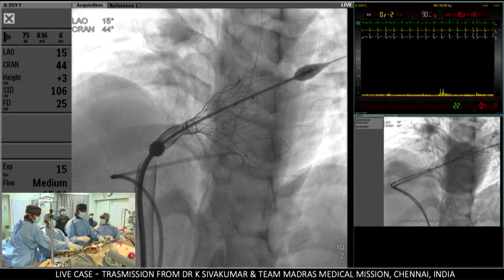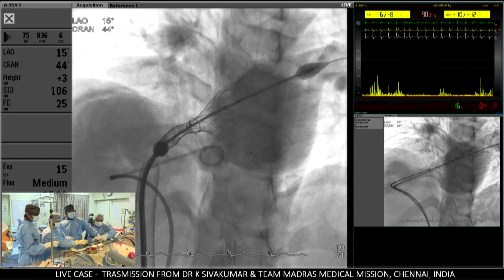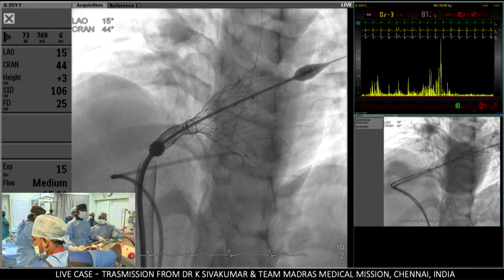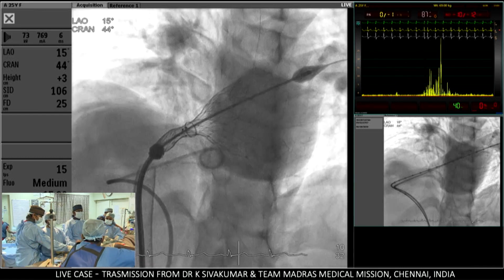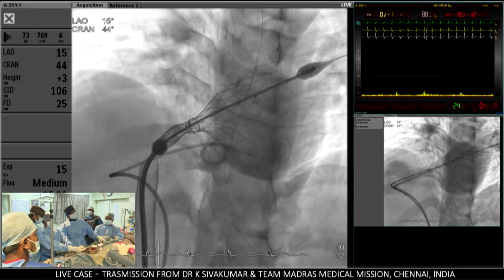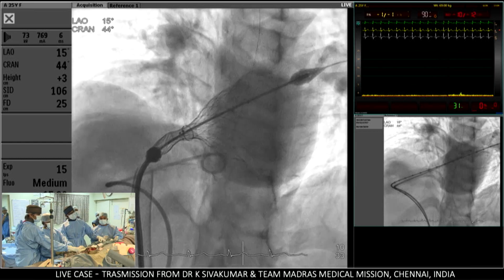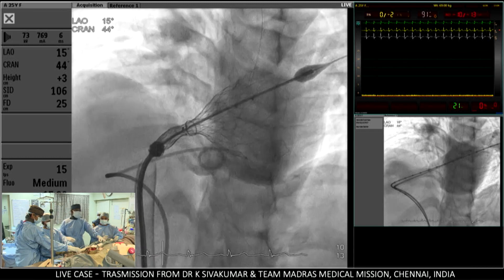I think I'm happy here, Pramod. Varakan, Tejasvi, can you get the injection? Now, see the picture. Well, Shiva, may I say something on this? Yeah. For me, the worst case scenario will be if the proximal flare is not catching the waist, and then it will fly distally. If I could, I would pull a little bit more and try to make sure that the proximal marker is a few more millimeters down into the RV.